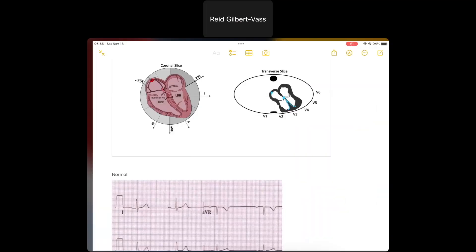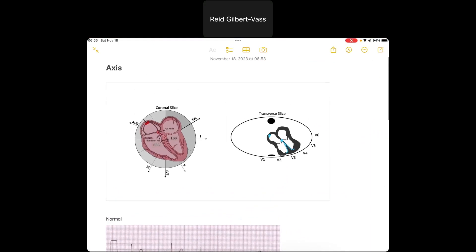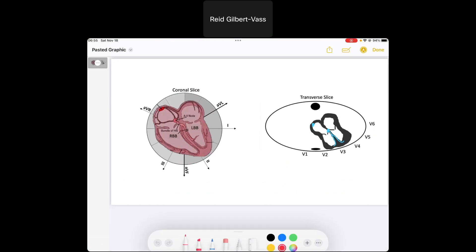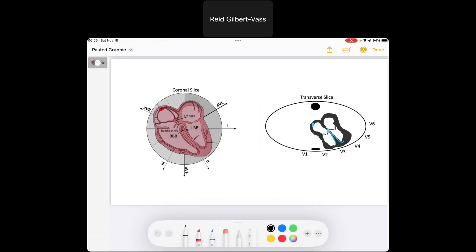Today we're going to go over calculating the axis, go over some examples, and I'm going to show you a few different ways that you can calculate the axis. When we're saying axis, just to define what it means, we're really talking about the QRS axis.